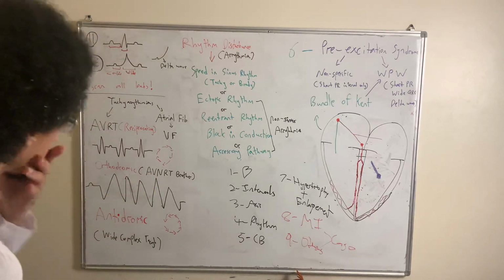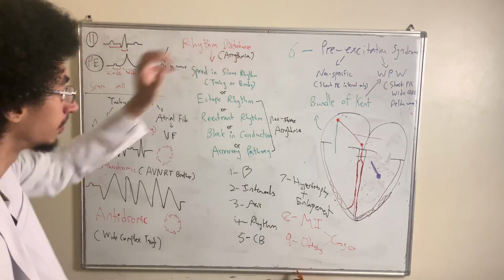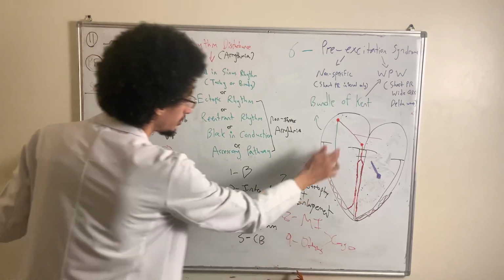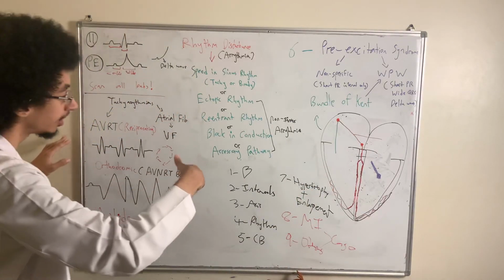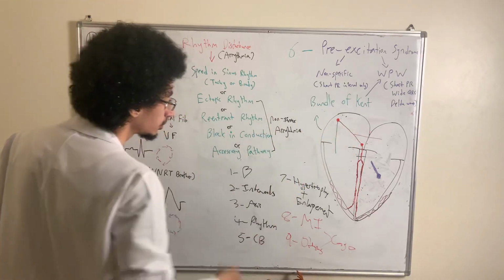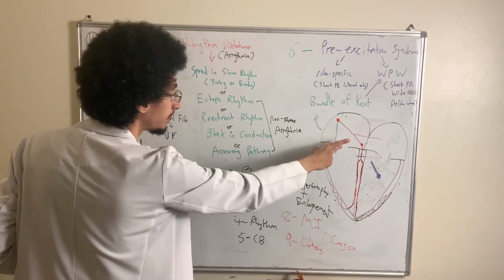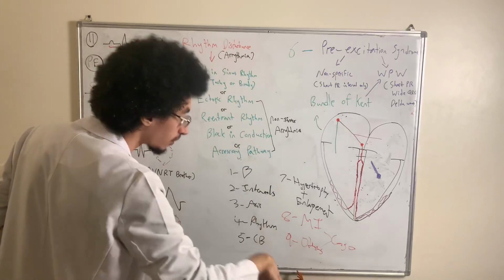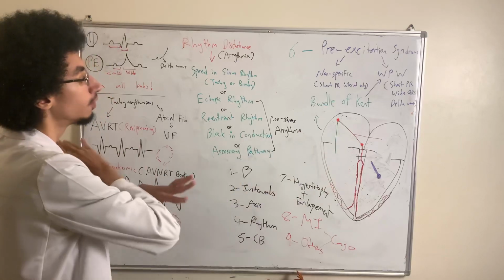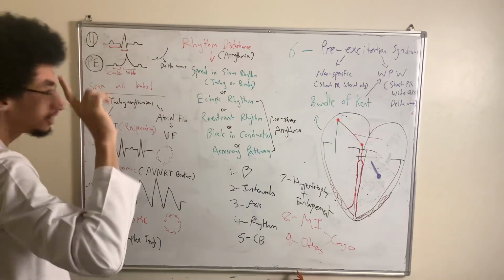So, let's talk about the EKG changes of a pre-excitation syndrome. So let's start with Wolff-Parkinson-White. If you have an accessory pathway that is evading the AV node's function, basically a shortcut, and now we have a wave of depolarization coming from the SA node to this accessory pathway, letting it go straight forward immediately towards the right ventricle, depolarization premature without any delay from the AV node, well, it will give us the following EKG changes.